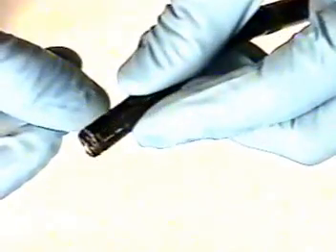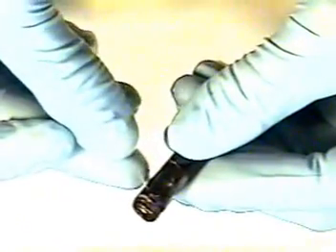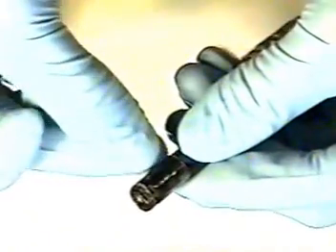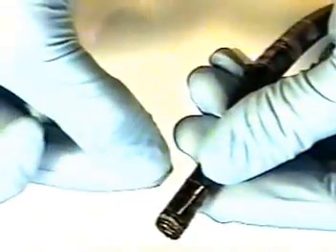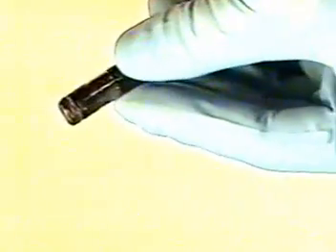We'll make another Scotch tape loop, again 2 millimeters from our previous binding at the distal end. Curl the tape over so it's easily removed after we have glued the new bending rubber sheath. This allows the tape to be removed easily again once we've glued. And one more Scotch tape loop, again approximately 2 millimeters from the old glue.